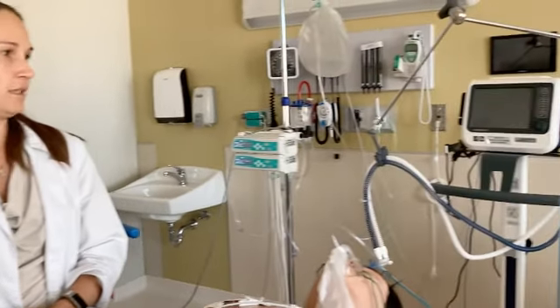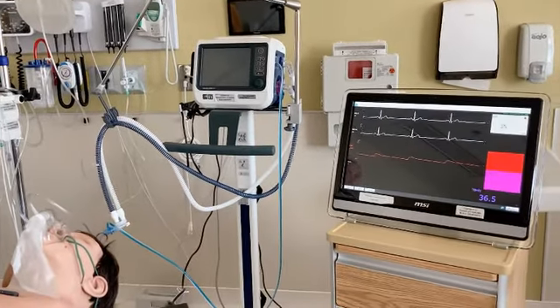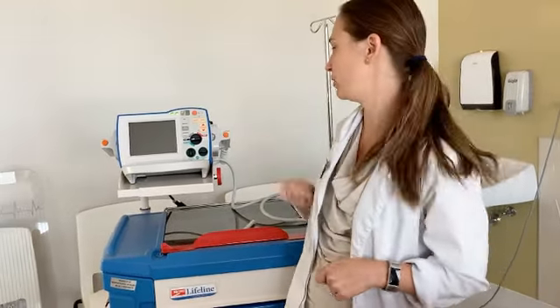I'm going to take a look at the monitor, make sure that the patient still needs pacing, and then together with the doctor, we will decide what is the best pacing amperage, so what is the energy and current that you should be giving to the patient to pace, and this information would be input into the defibrillator.